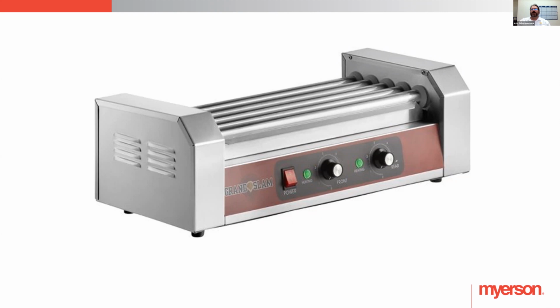Problem is you will incorporate bubbles. So you have to kind of plan. If you're going to do that aggressive shake, I would let it sit overnight. You could put it on the roller overnight, because that will still allow the bubbles to find their way out, and make sure that it does release those bubbles before you print. So the mixing is important to make sure you do have an accurate shade.